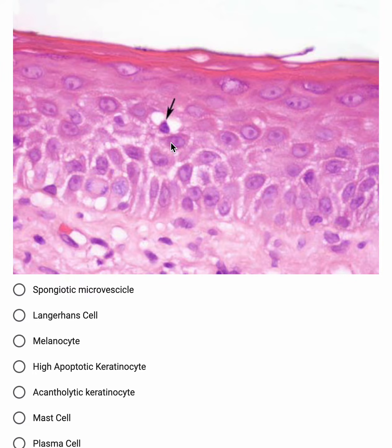An apoptotic keratinocyte, again, if it's an apoptotic keratinocyte, the nucleus is much more pyknotic, shrunken. This is a fairly intact nucleus, much more rounded. Acantholytic keratinocyte, again, you should see the cytoplasm of the keratinocyte. There's no cytoplasm whatsoever. It's just a nucleus surrounded by a vacuolated cytoplasm. An acantholytic keratinocyte will be this big, or at least this big, and the nucleus is vesicular, as you can see in the other nuclei. The character of the nucleus is completely different.